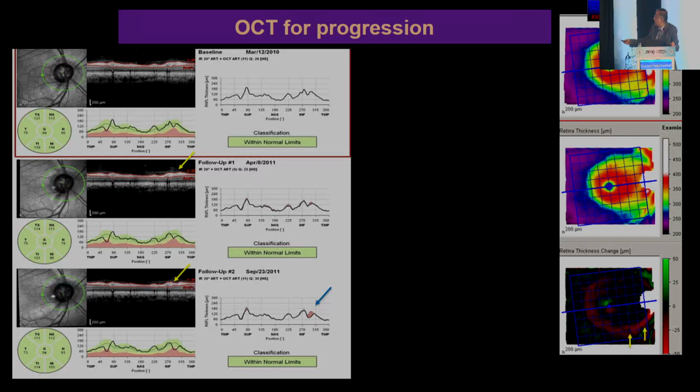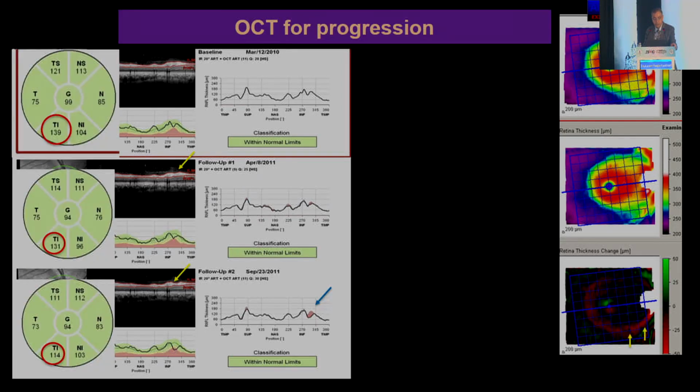Mind you, it's all green. So if you go with that green level, you're not going to find any change. It's here, you can see it. Can you look at the macula simultaneously? Yes. You can see the baseline measurement, subsequent measurement, only 5 months later, and you can see a huge loss of macular thickness that is happening both superiorly and inferiorly. What is the cutoff that I use? Numerical values. For the sector value, I use 10 microns because the standard deviation is 4, so 2 standard deviations is 8, and we round it off to 10.